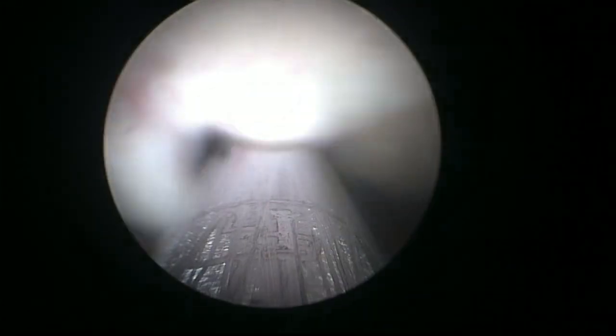This is another amazing development of endoscopic enucleation of the prostate. I remember watching morcellation was a pain, it would last 1 hour or more. Now we can do morcellation in minutes, which is a total game changer in endoscopic enucleation of the prostate, because it transforms enucleation into a simple procedure. As I said, we do 5 cases today, which is extremely efficient, because these procedures take 30, 20, 40 minutes, depending on the complexity, and allow for very fast change of patients.